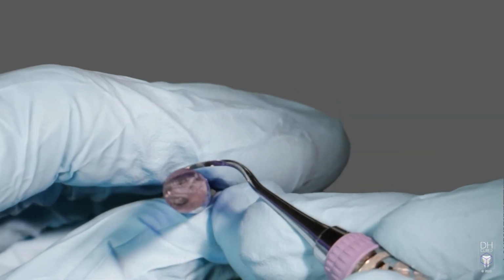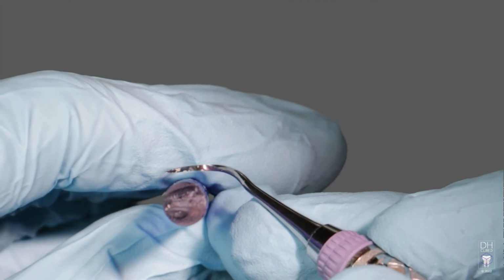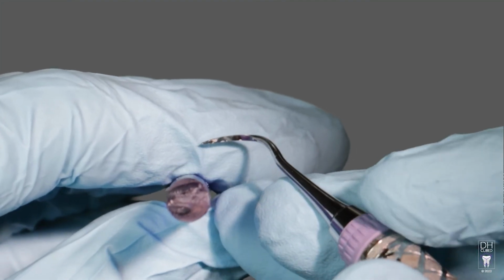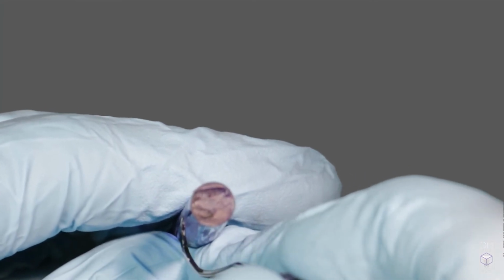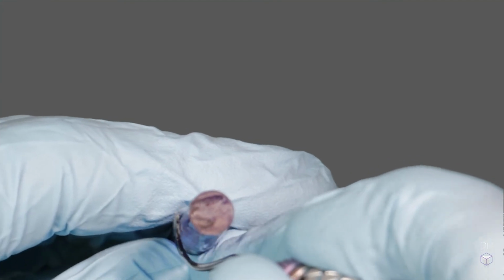When an instrument is dull, our tendency is to press firmer, hoping it won't slip, when in reality this is when it is most likely to slip. As you can see, this side of the sickle is not shaving the test stick, especially the tip end, which is barely shaving it at all.